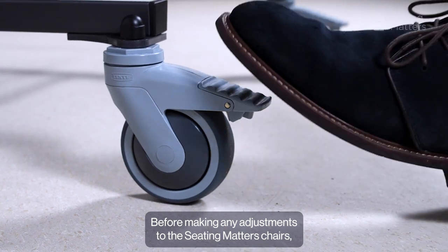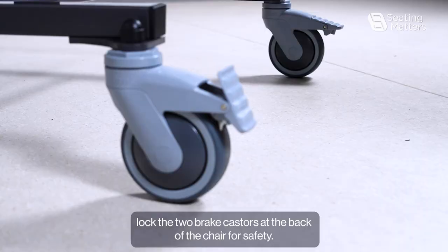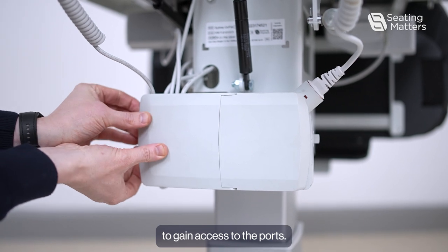Before making any adjustments to the Seating Matters chairs, lock the two brake casters at the back of the chair for safety. To replace the control box on a Sydney, first we need to remove the cover of the control box to gain access to the ports.